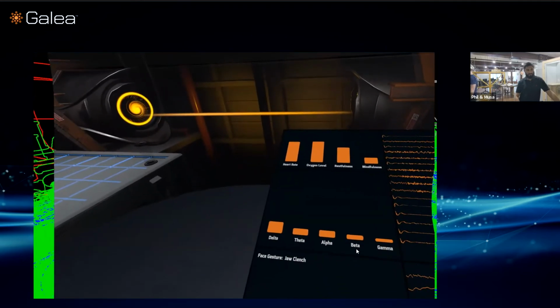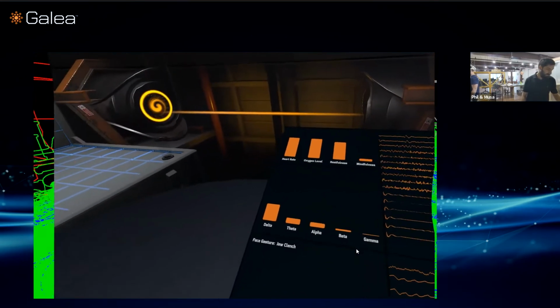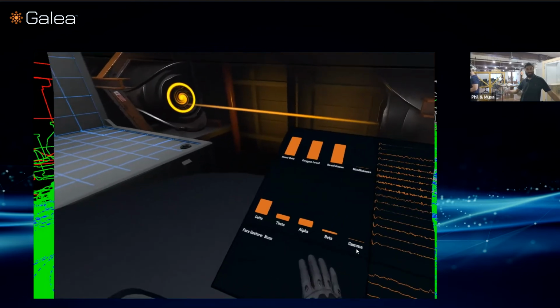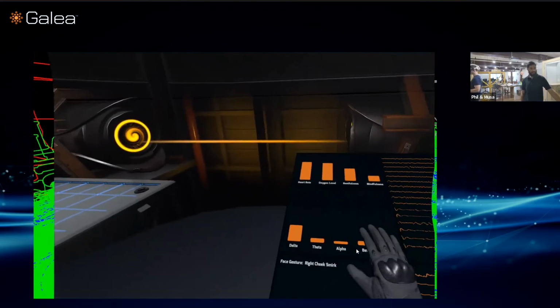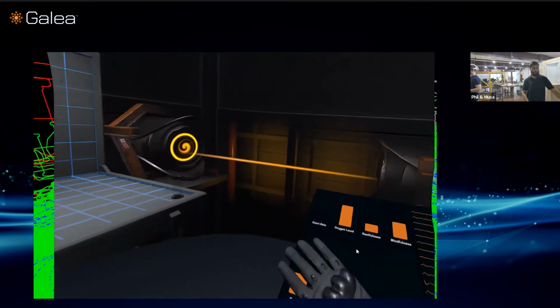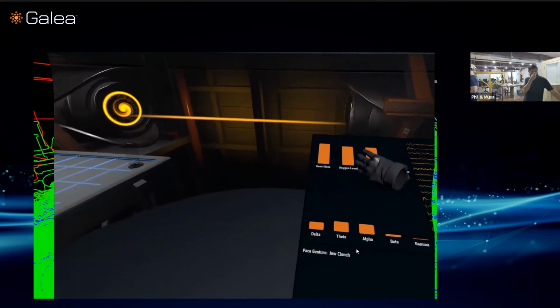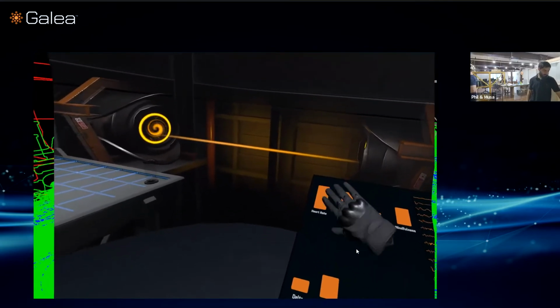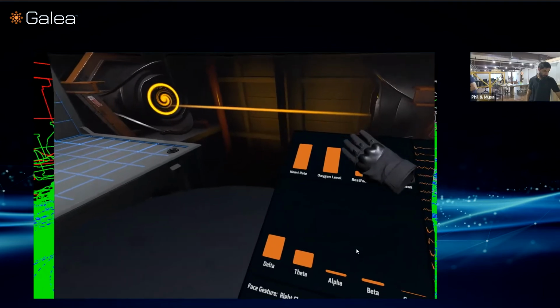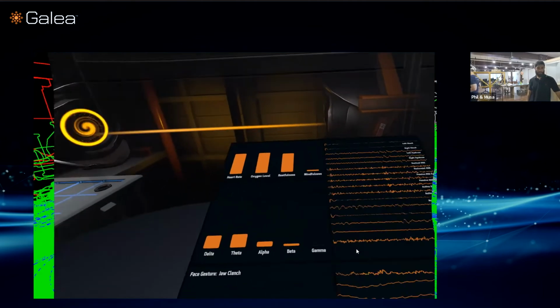And then Phil, I think you can continue talking about the metrics. So yeah, it was kind of interesting here. I don't know if you saw that before the Zoom call, we had to reset the Zoom call, but you could see my heart rate going down as I was holding my breath there pretty clearly. The oxygen level, I don't know if you guys can see that in Zoom, but I noticed that going down a little bit too.